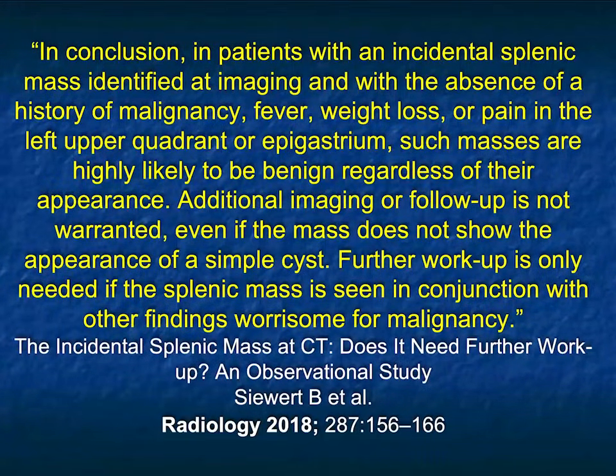So we started 5 different lectures ago, talking about how do we work up the incidental splenic mass at CT. What do we ignore? What do we pursue? Again, we mentioned that incidental findings with no symptoms, no history, most of the time we can leave alone.